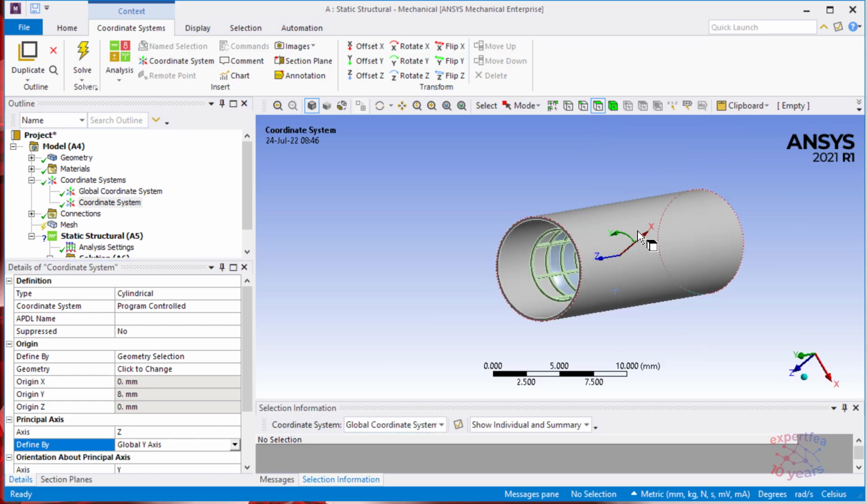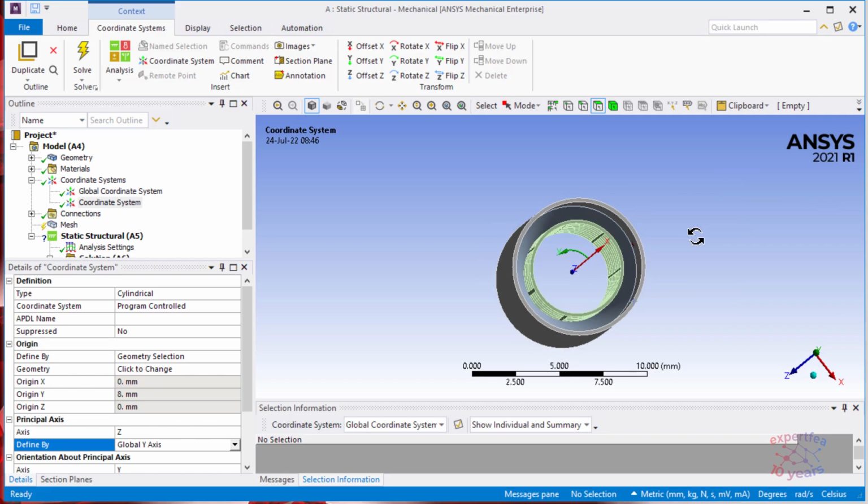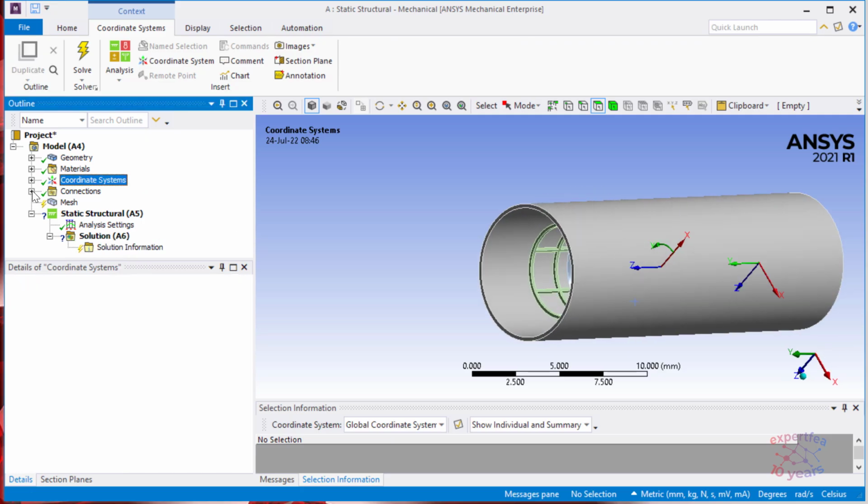So you see we have the proper rotation because we need to define the displacement about the X-axis, which is in reality all the X-axis from this rotation plane, from the, let's say, XY plane. All this being done, let's go to contacts.